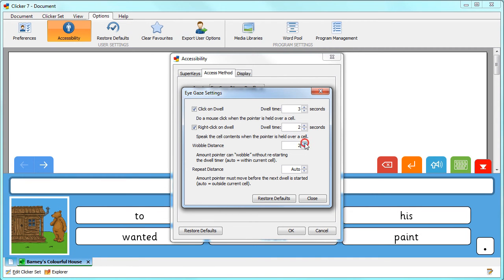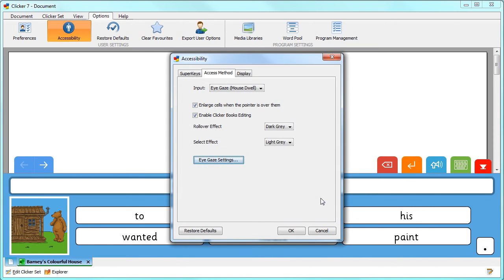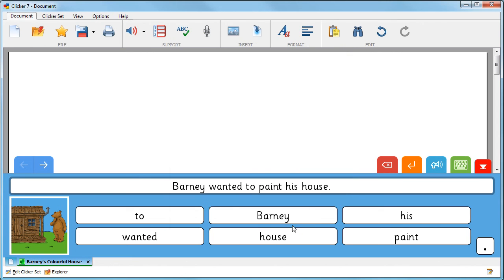Here you can choose how far the pointer can move without restarting the dwell, and how far the pointer needs to move to begin a new dwell. When you're happy with your settings, click Close, and then OK.